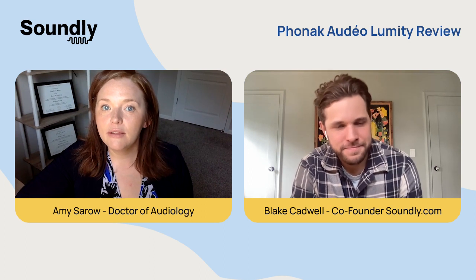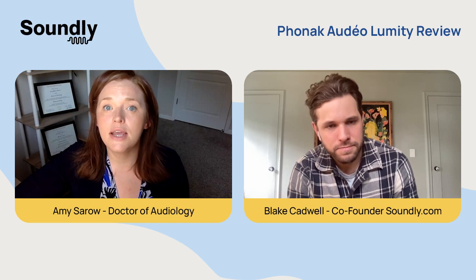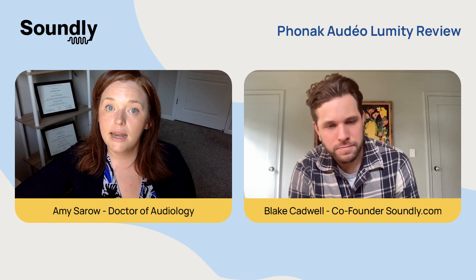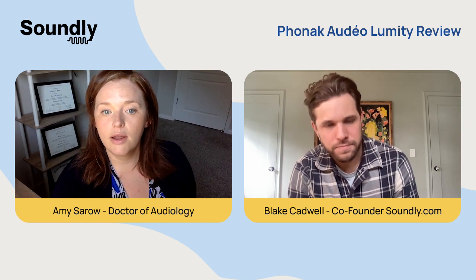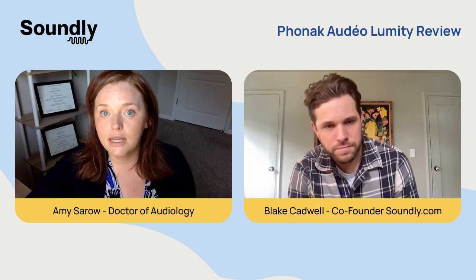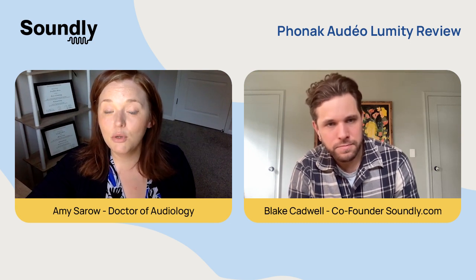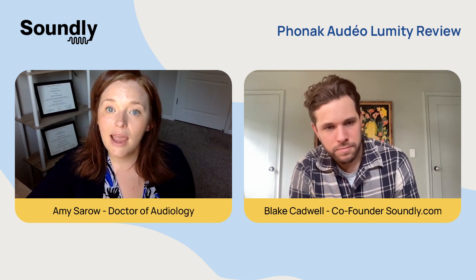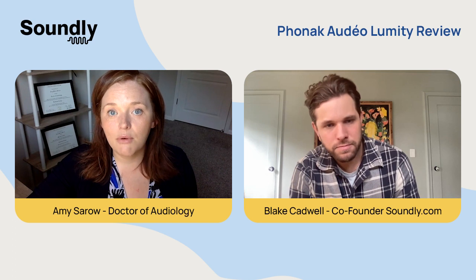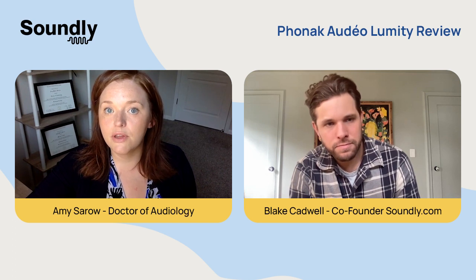Some things to know about the Phonak Lumity: it's a very popular hearing device — if not the most popular in the country. It has various form factors. You can get it as a slim, you can get the regular standard one, and you can get it with extra waterproof capabilities with the Life product. It does have universal Bluetooth capability, so if you like to have multiple devices connected, this is a great option — or if you have an Android phone. And they have enhanced background noise management compared to some of their previous products.